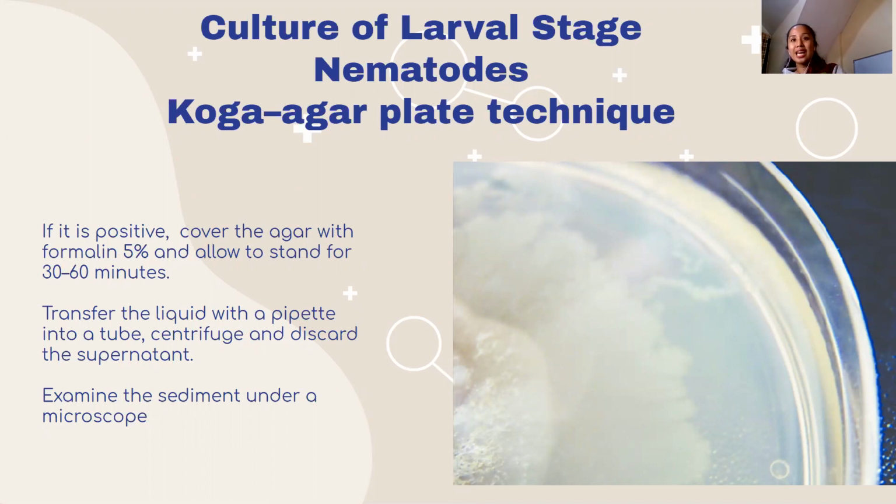So, if you want to see the larva, you could do the Harada Mori, Baermann technique, or Koga agar. So, usually hookworm and Strongyloides.